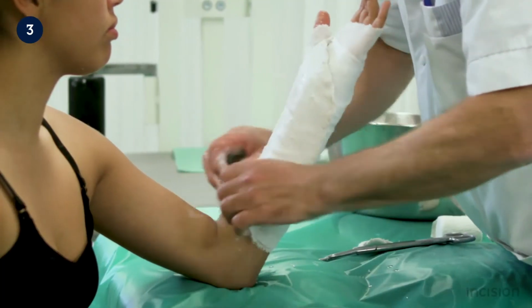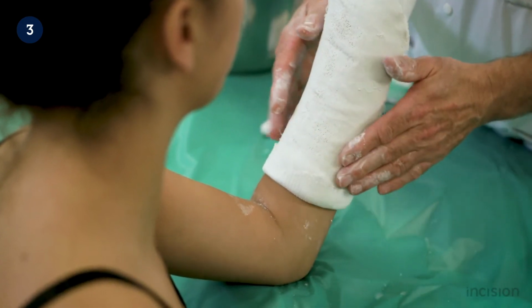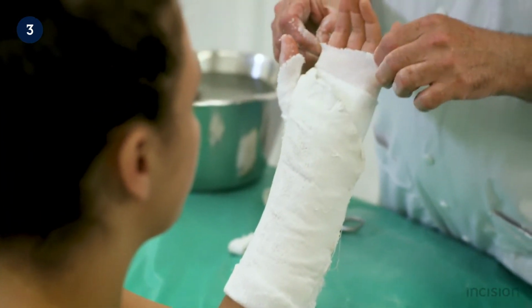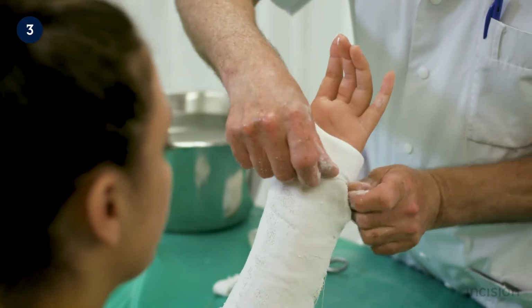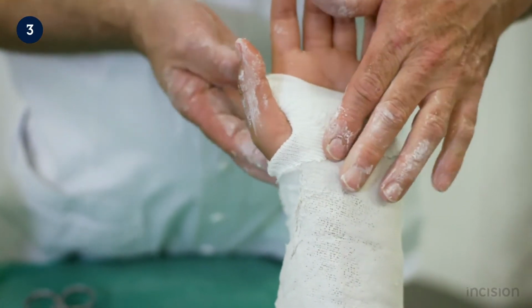The longer stockinette and padding are now folded over the plaster, creating smooth edges. Take note how this is done distally, leaving the palmar crease exposed. Also note how the stockinette is folded back over the thumb.